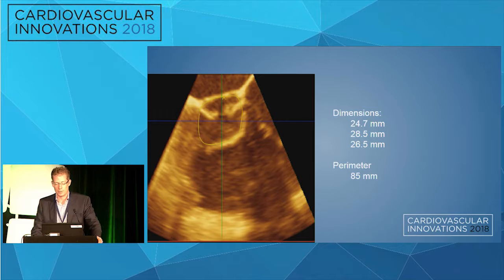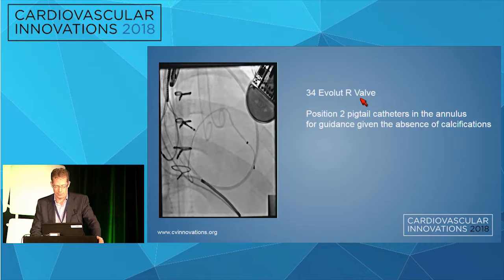So with the magical hands of our echocardiographers, we were able to devise that potentially at the level of the annulus, the perimeter was somewhere around 85 millimeters. However, immediately underneath the annulus, the LVOT just funneled out like a complete circle, and it was almost close to 95 to 98 millimeters, which posed an important limitation.